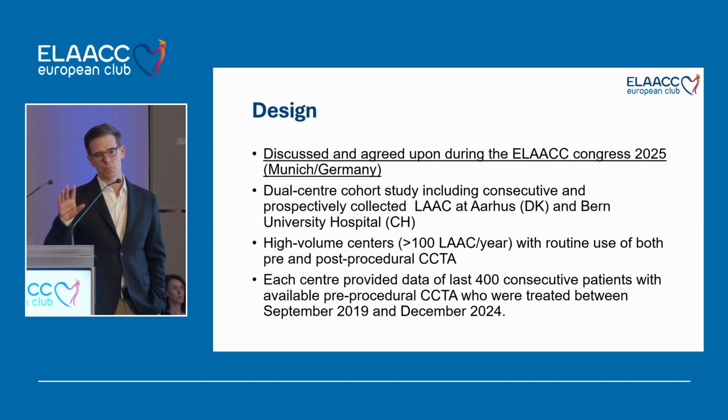We decided mainly for practical reasons to do it in a two-center approach, because as you can understand, the availability of CT in a large proportion is not that easy, together with, of course, the availability of the clinical characteristics and outcomes. And you need serial imaging methods of the same nature, in that case CT, so not only pre-procedure but also at the imaging follow-up time point.